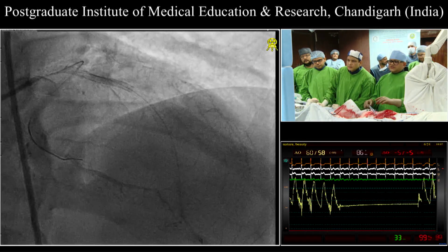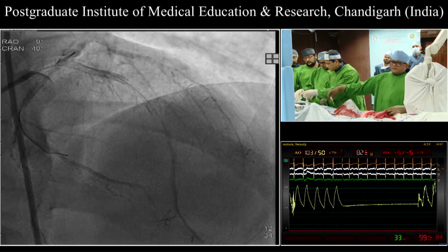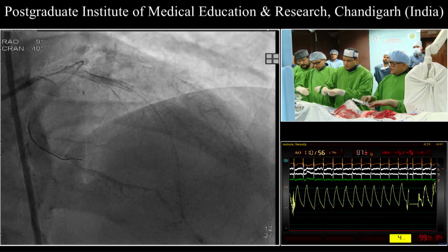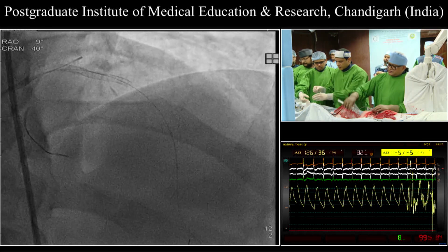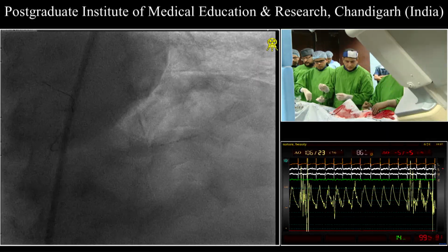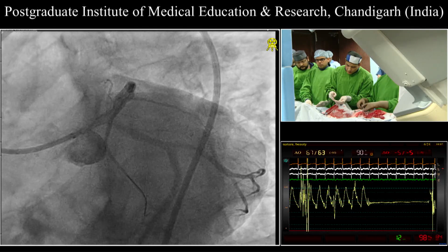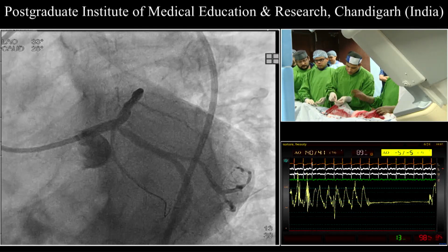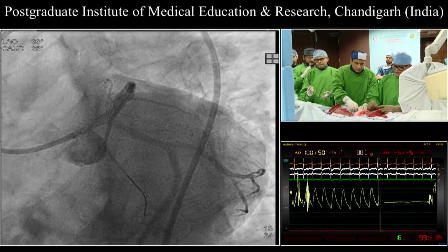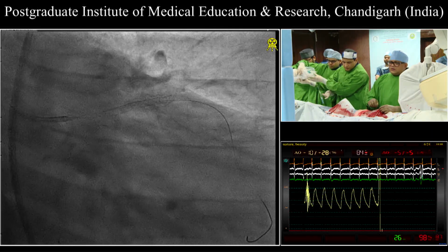So distally it's fine. OCT. Let's have the spider. Spider. Maybe now the OCT may jump. So this is the spider view, and let me go ahead for the OCT. Caudal, please. Definitely an angiographic carina.